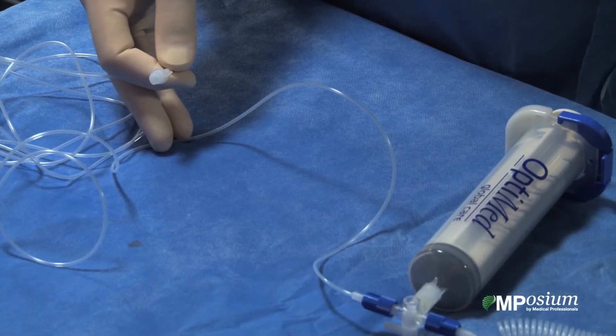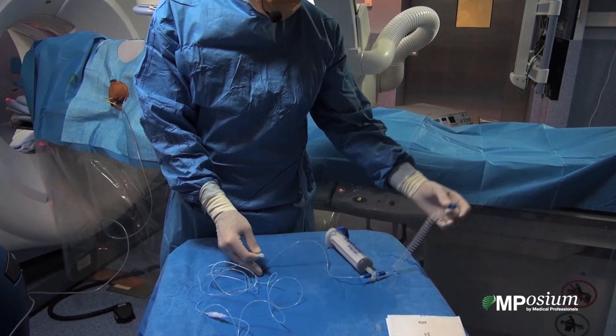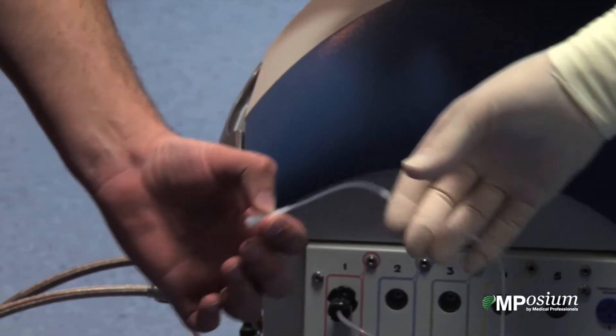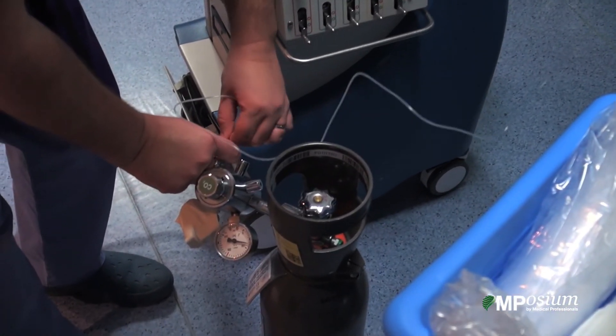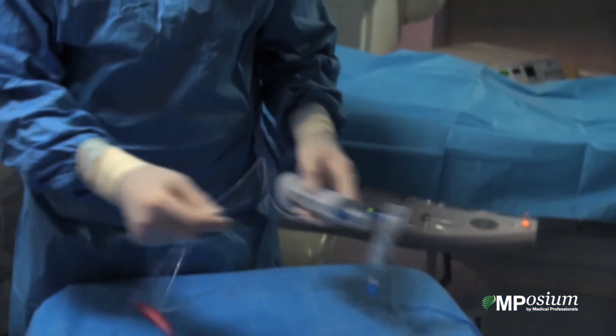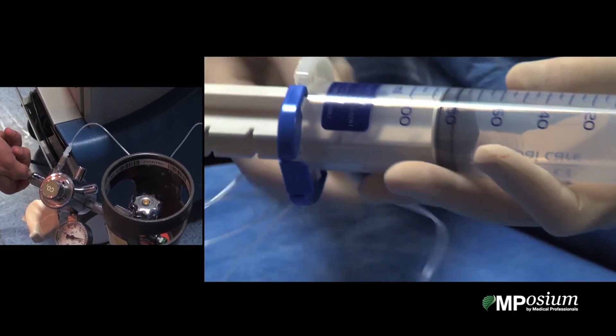I will use a syringe to exit the carbon dioxide through the 22 gauge needle that will be locked to this part. The first step is to plug on the carbon dioxide bottle part. Then when you open the carbon dioxide, you will see that the injector will go up, and then we are set up.